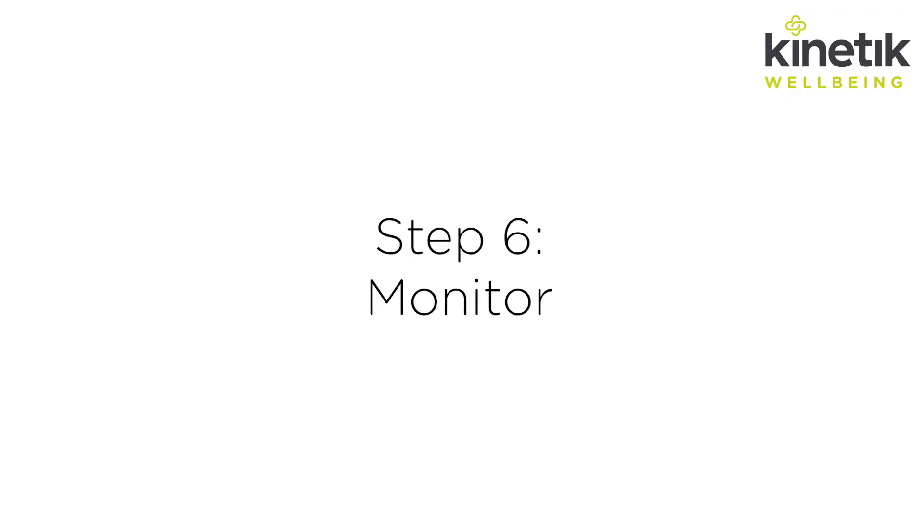Step six: monitor. It's a good idea to check your blood pressure regularly. If you're concerned about your reading, speak to a healthcare professional.